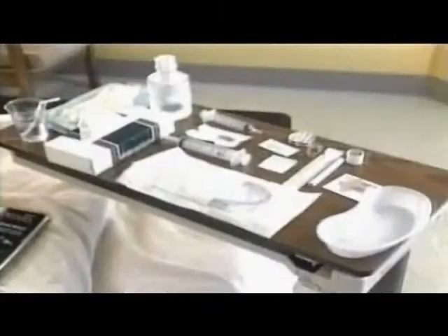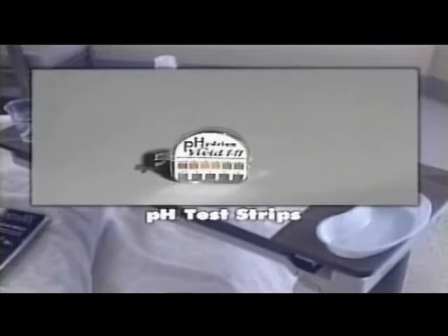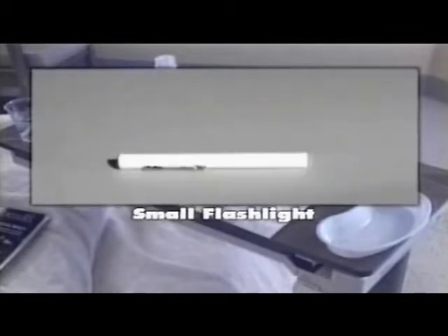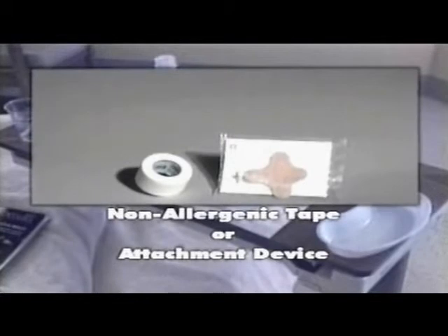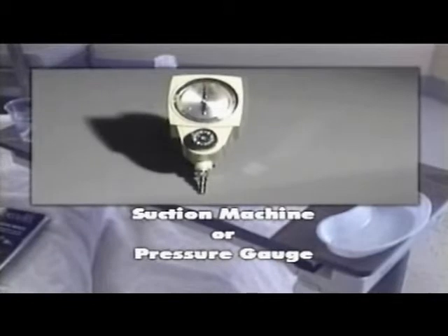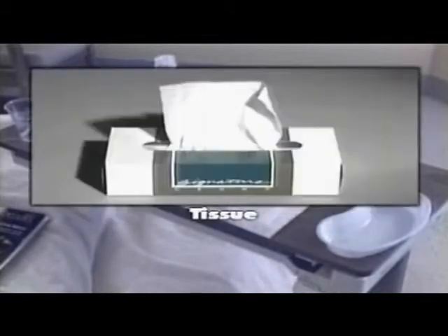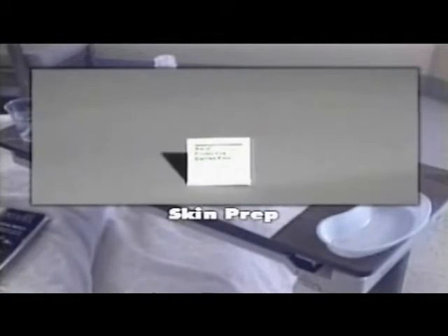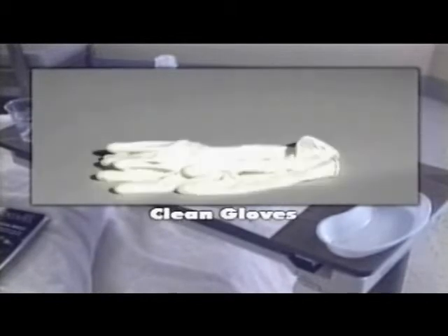Gather the necessary protective equipment. Additional equipment needed includes water-soluble lubricating jelly, pH test strips to measure acidity of the gastric aspirate, tongue blades, small flashlight, 20 to 50 milliliter catheter tip syringe or a septo bulb, non-allergenic tape or attachment device, safety pin and rubber band, a clamp, suction machine or pressure gauge if wall suction is used, towel, glass of water with straw, tissues, normal saline, skin prep, tincture of benzoin as needed, a basin, stethoscope, and clean gloves.